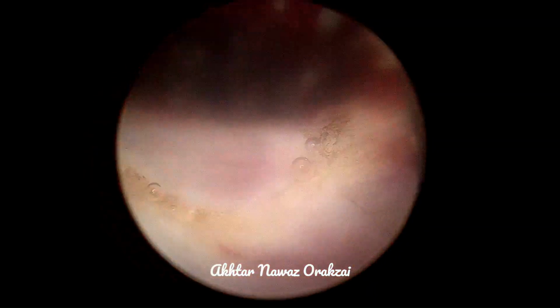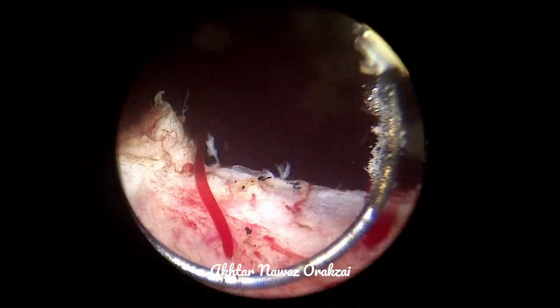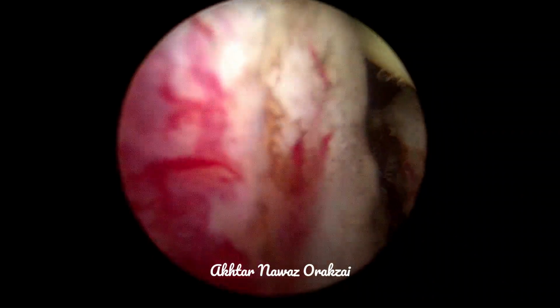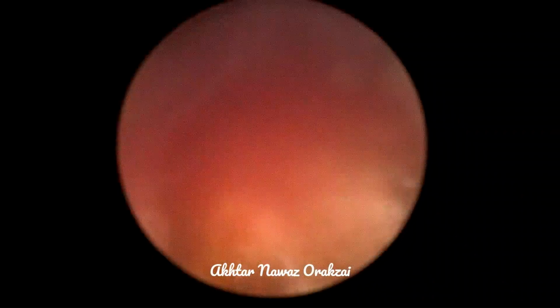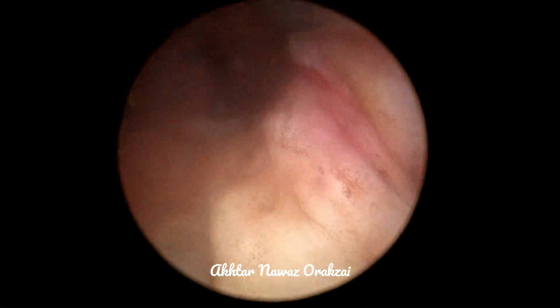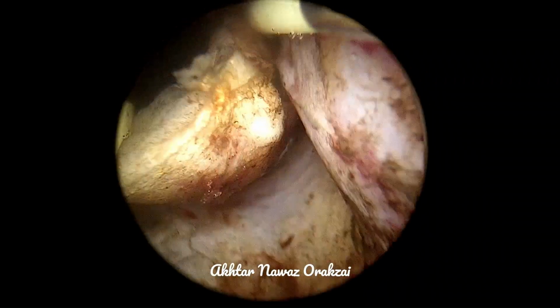Complete resection of the median lobe at this stage will lead to undermining of the bladder neck. This same crater is continued towards the verumontanum.